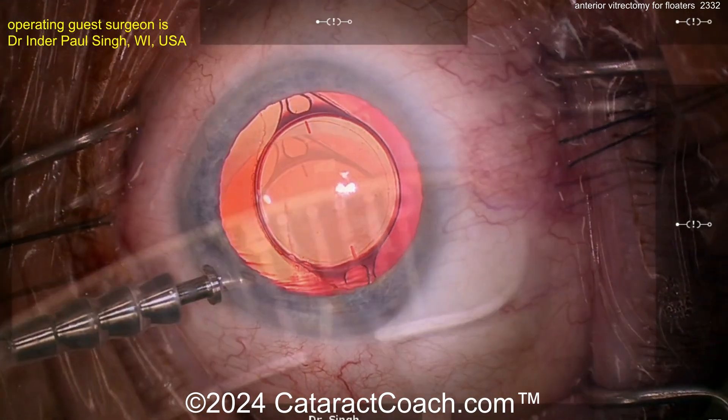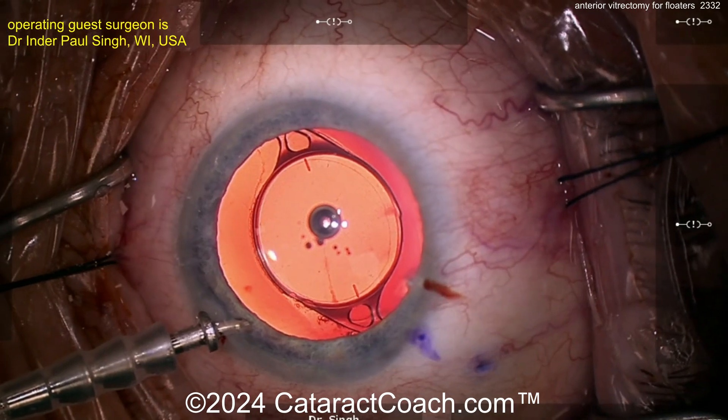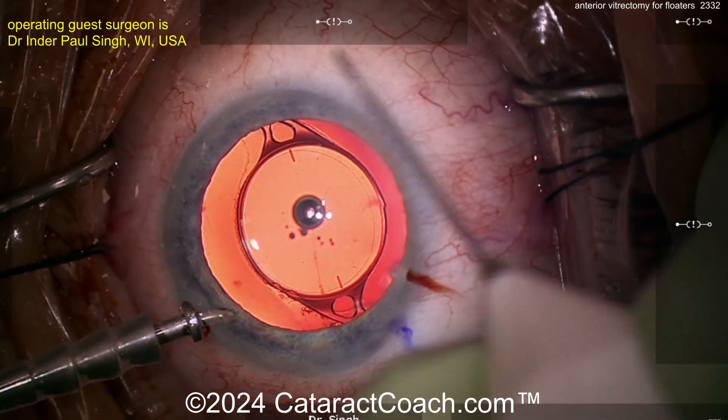Measuring about three and a half millimeters behind the limbus. I'm going to mark where we're going to enter with our one-step vitrector needle. Let me show you the needle quickly — it's a 27-gauge needle, there's a bevel, you can see the bevel-up fashion — just to show you how we want to enter into the eye.